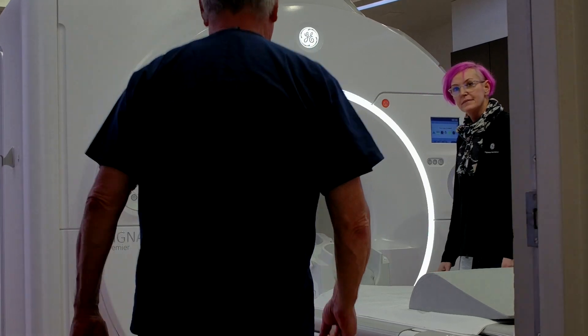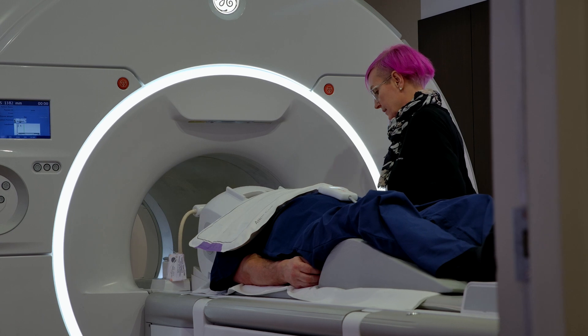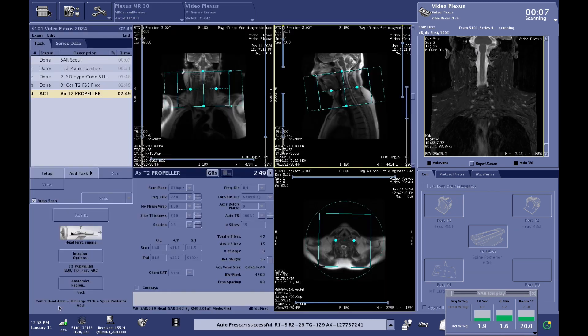Let's step over to behind the console and give you an idea of what that would look like scanning with some of these great applications. So let's look at the scans we just did here.